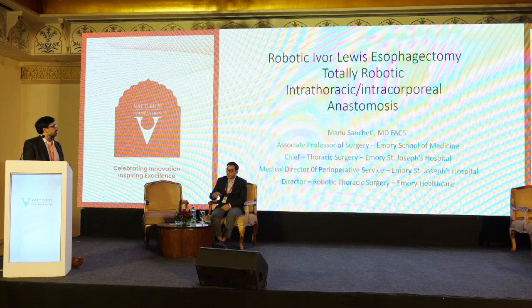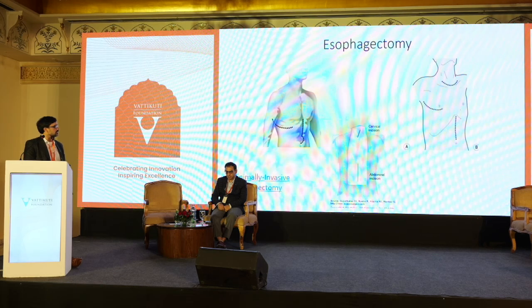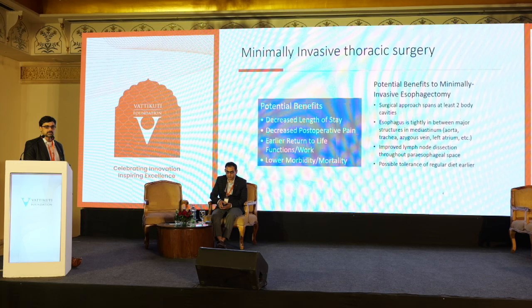Okay. So my next one is robotic Ivor Lewis esophagectomy with a totally robotic intrathoracic anastomosis. And so esophagectomy as a whole, you know the open procedures, the various ones that are used.